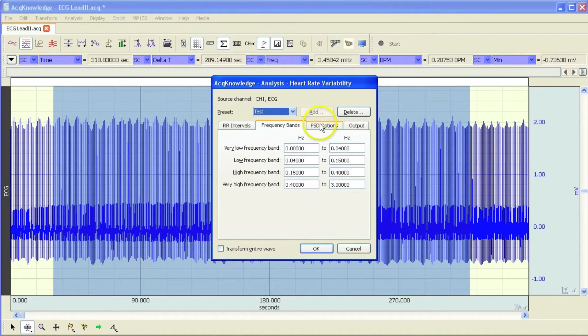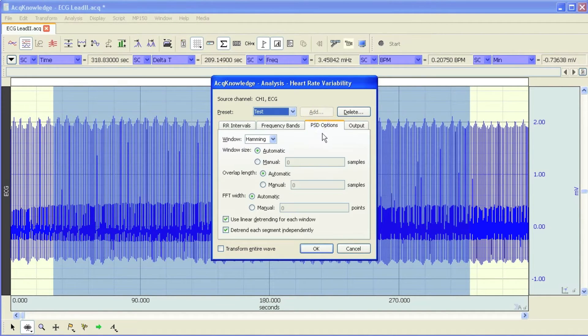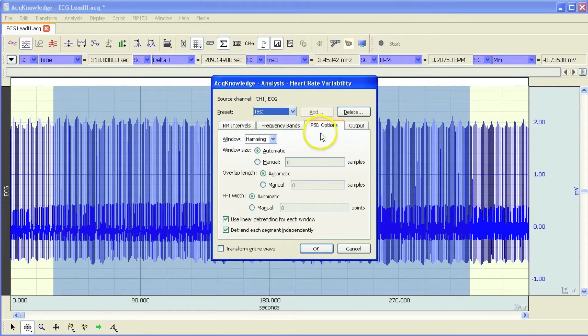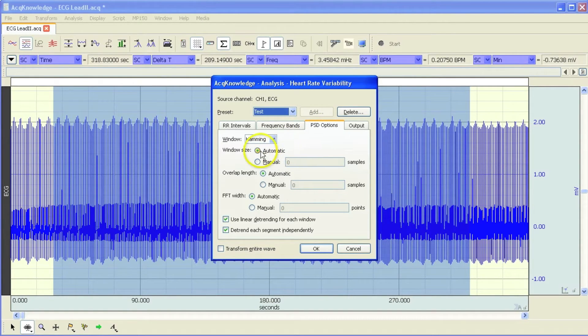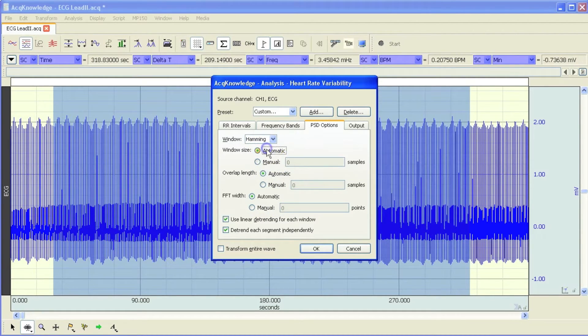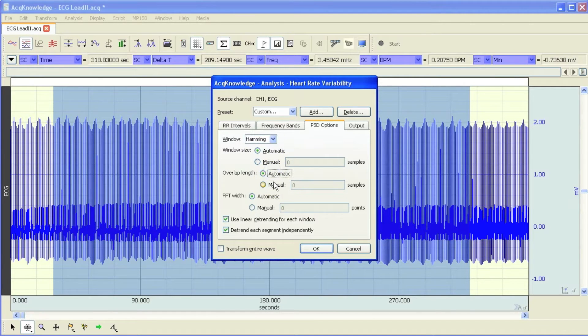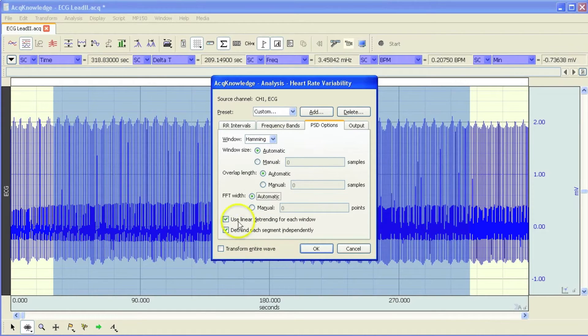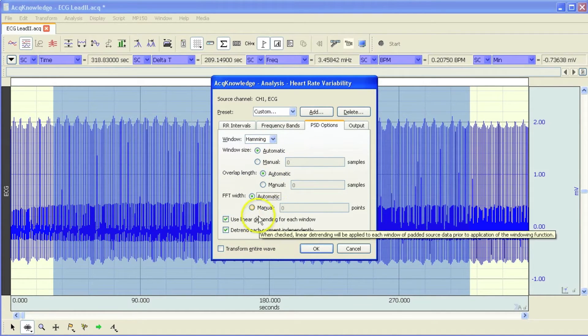The next tab allows you to control the power spectral density settings. Typically, the automatic options will work nicely for you, but again, if you want to make manual changes to compare settings from different software, you can go in and do that. But for the purposes of my demonstration, I'm going to use the set to automatic.